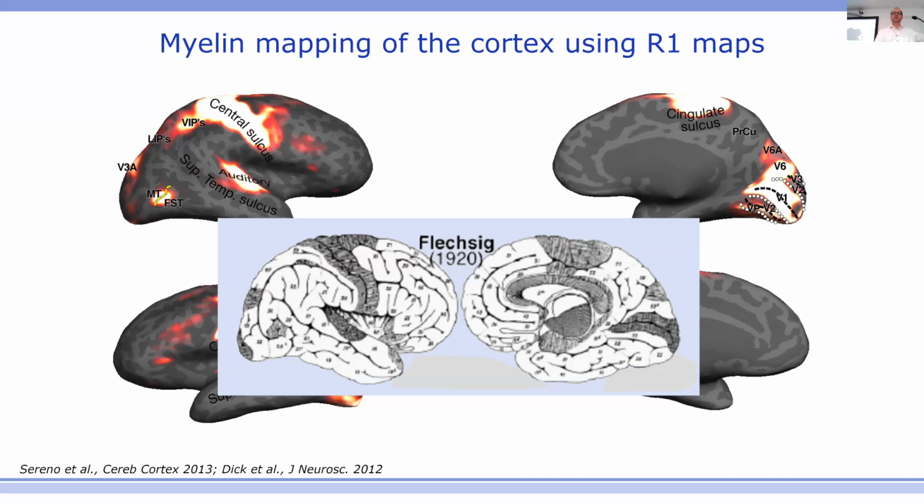But of course, you can do many more things with the in vivo situation. You can do functional imaging for comparison. You can do large group studies and so on, which you can't do with the histological post-mortem approaches. But to tap into the theme that came up now several times already, modeling, good time-honored tradition here in the field.